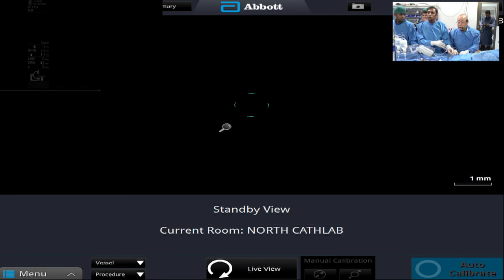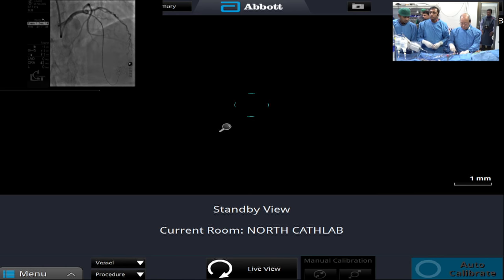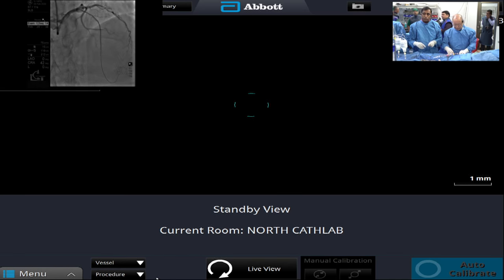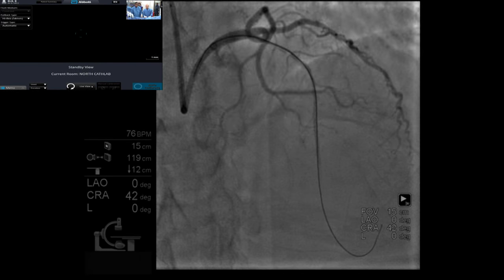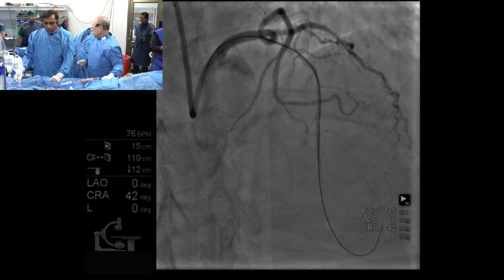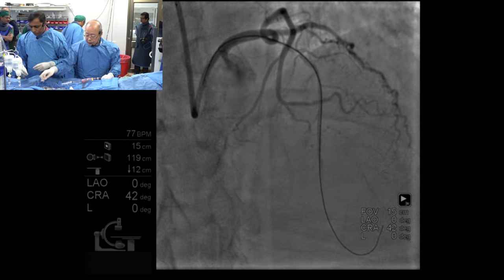But this is not OCT. Right. So the dilatation is not enough. Proximal dilatation takes a little bit of time, so some recoil may block the flow, right? Also, I think the competitive flow from the right coronary artery would not allow easy flow around the device. So, can I have a microcatheter? I think we changed the microcatheter. Yes. And can I have a Runthrough wire? I want to change the wire.